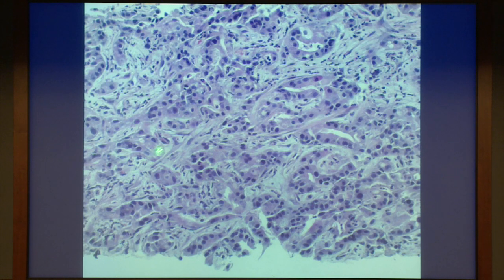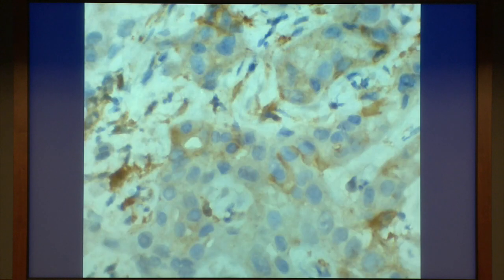This is a metastasis to the liver of pancreas adenocarcinoma that last week we were asked to do a PD-L1 stain on, to see if, off-label, the patient could be treated with a checkpoint inhibitor. And in using GI criteria for that, this stain, again, the chromogen is always brown, can be very tricky for us to analyze.